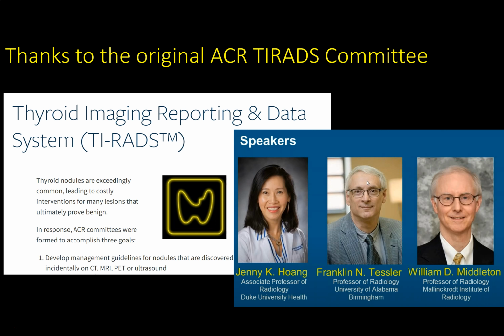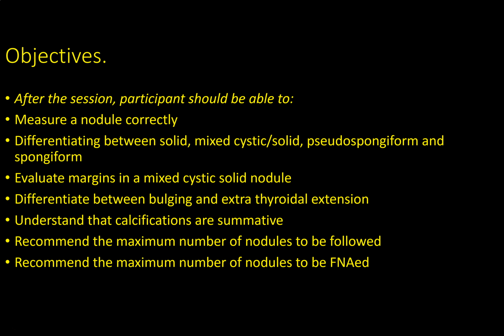As we can imagine, just creating a reporting system is no small feat. And I love the fact that they supplemented it with excellent webinars and helpful charts to ensure that there's widespread ease of uptake. My objectives are listed above. I did have some specific items that I wanted to cover based on my experience thus far using TIRADS.